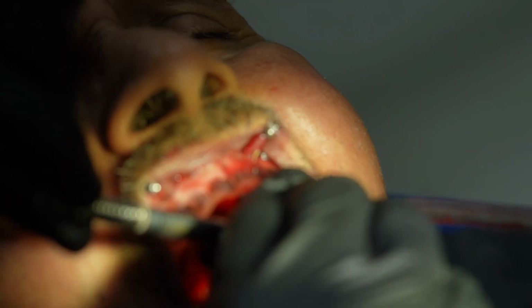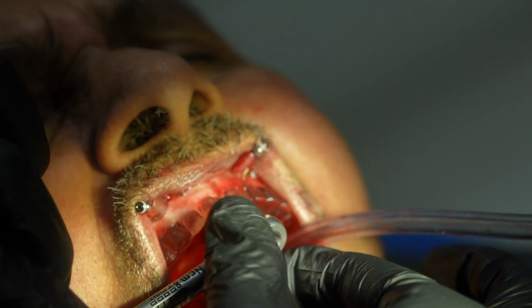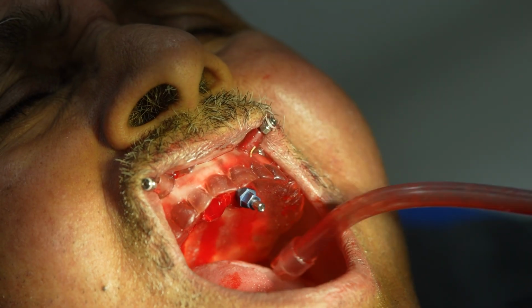Will reach the torque, but I will have one more and we are done. We got the first one done.